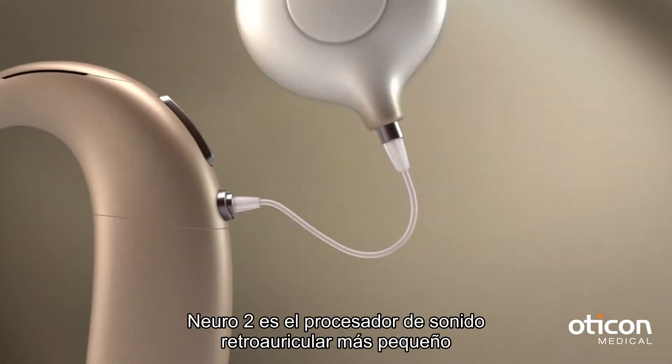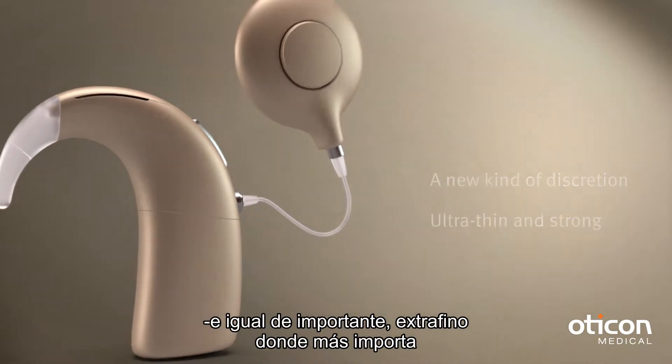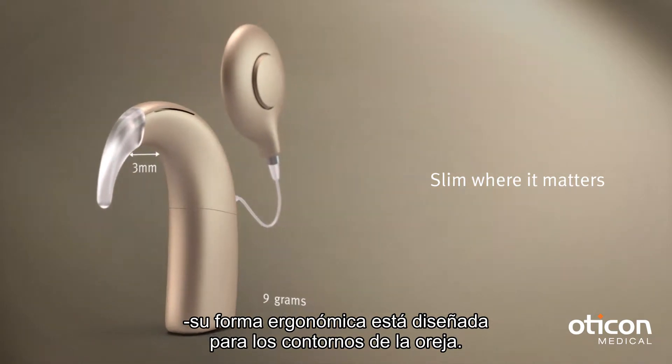Neuro 2 is the smallest behind-the-ear sound processor ever. And just as important, it's slim where it matters, with an organic shape designed to comfortably match the contours of the ear.